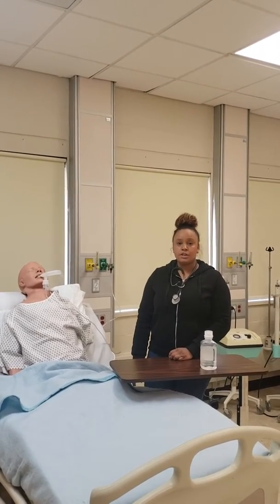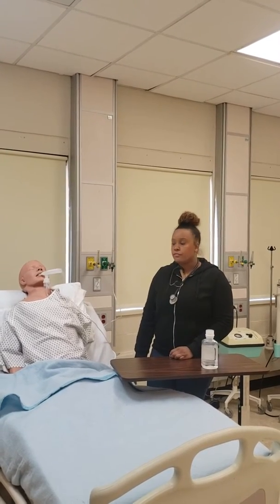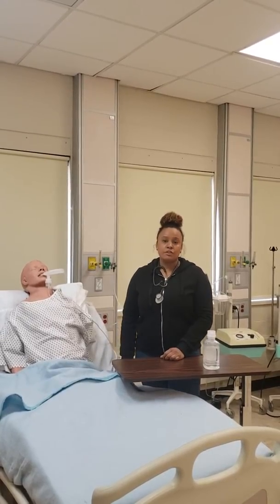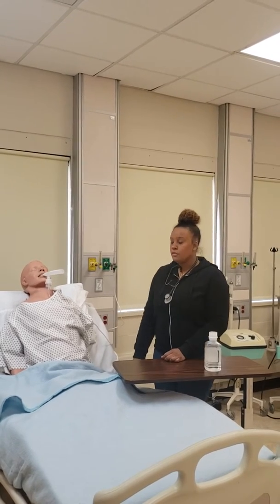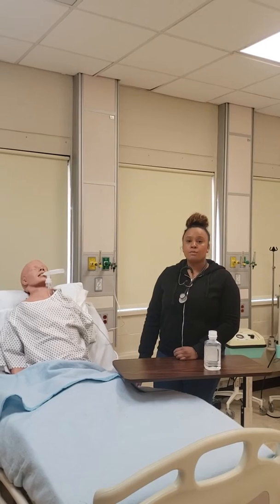I will assess the patient's color, level of dyspnea, and breath sounds. If there was an adverse reaction, I will stop the treatment. I will stop and discontinue treatment if there is an adverse reaction, such as a heart rate increase 20% above the baseline. And notify the appropriate personnel.